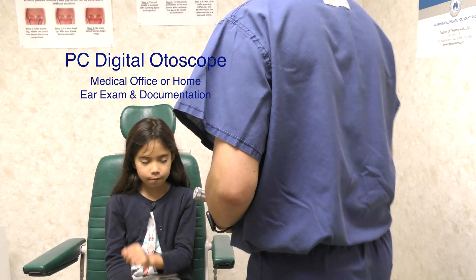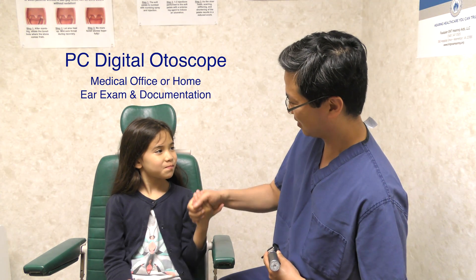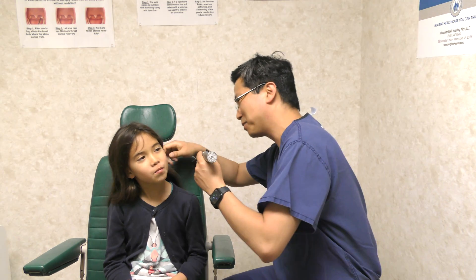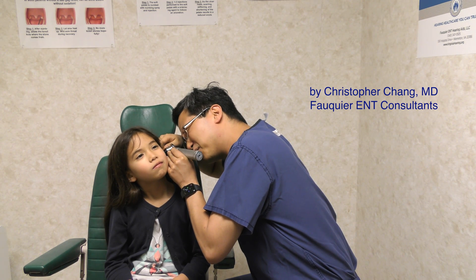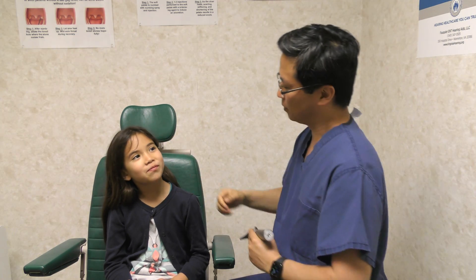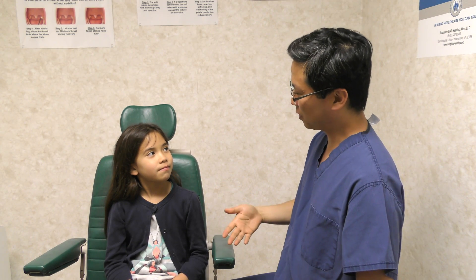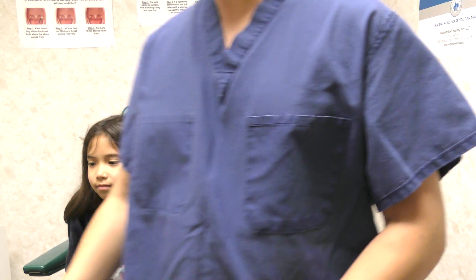Many online stores, including Amazon, sell different models of digital otoscopes that can be purchased for around $20 to $75. Depending on the model, it can come with its own monitor or a cable that can connect to a smartphone or computer. The model we are going to demonstrate here is one that can connect to any desktop computer, made by AnyKit, and costs around $20.